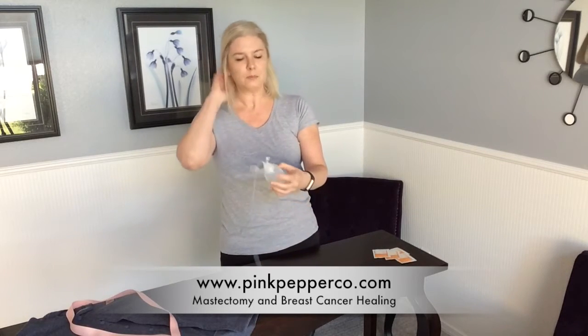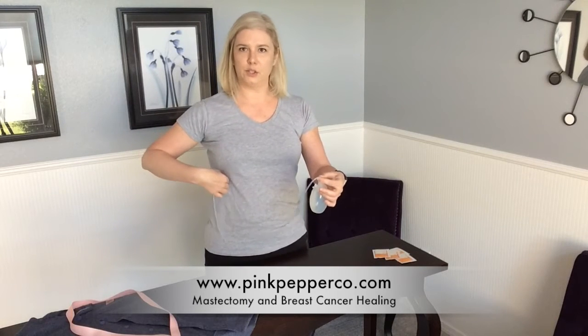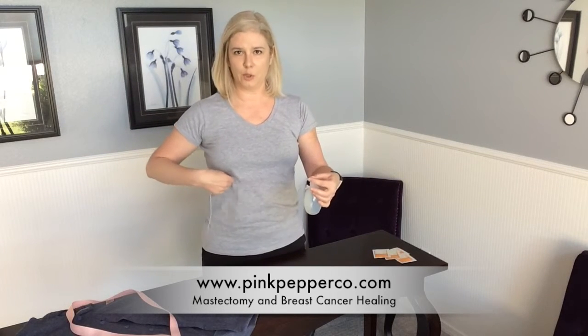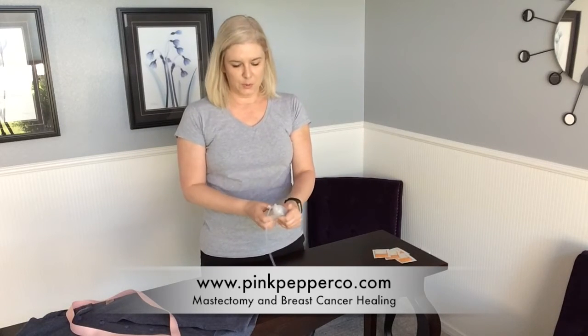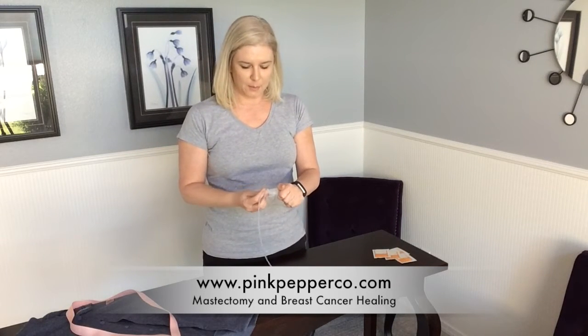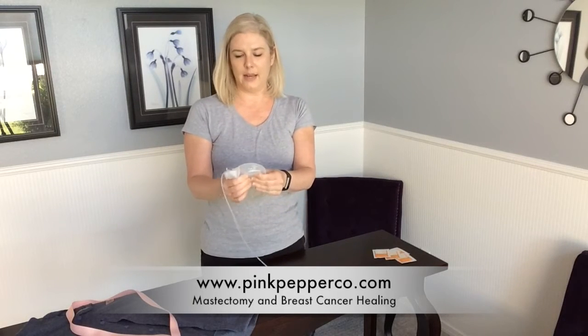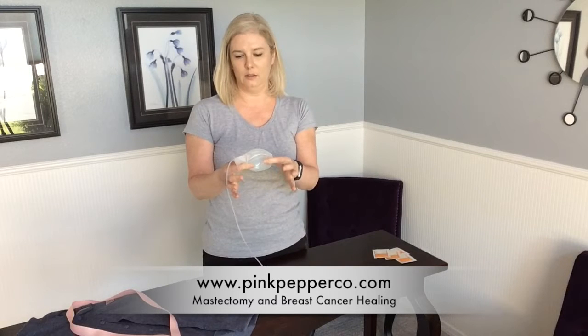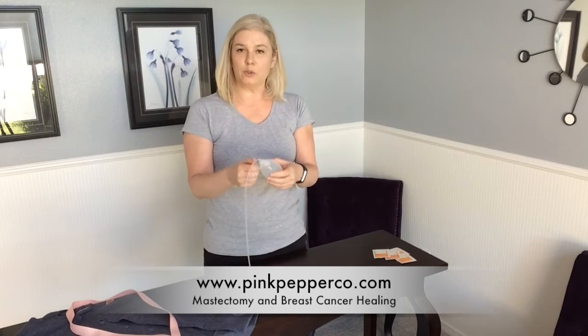Okay, so here's the drain. This tube is actually going to be inserted somewhere around your torso area, and then it's going to slowly fill. So what it'll look like, basically, it'll be deflated like this, and as it starts to fill, it'll start to get bigger like this. And they're going to want you to drain it.